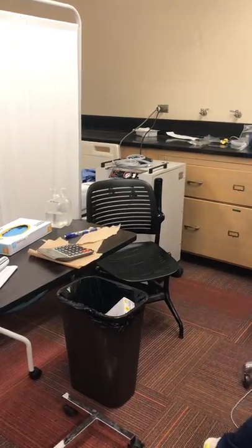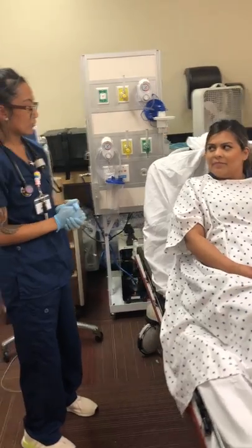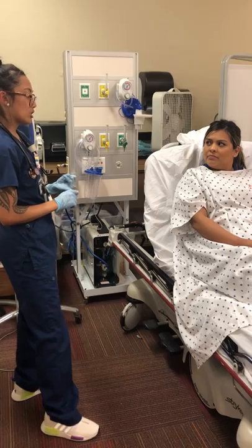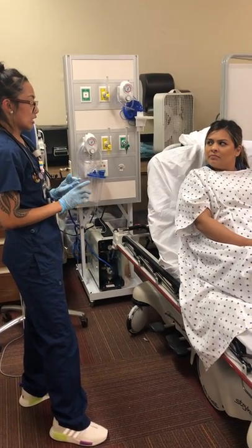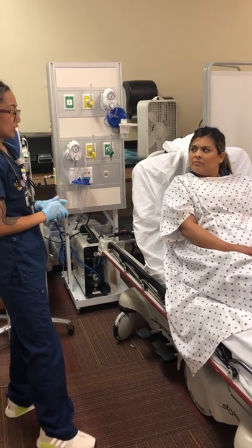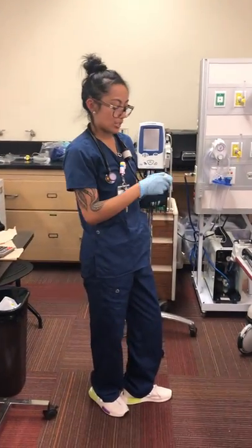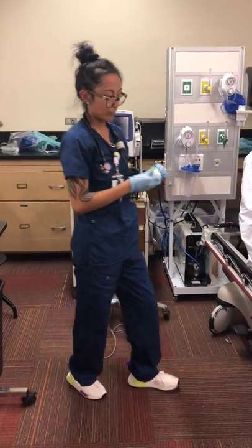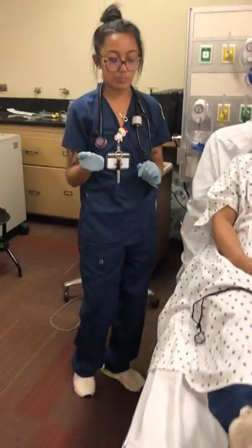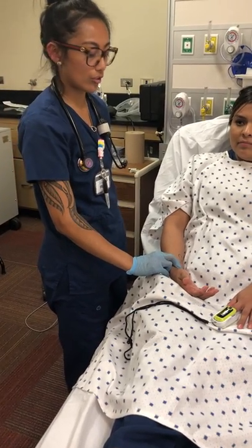Are you able to breathe okay? Do you still feel like you're wheezing a little bit down at the bases? No. From here I'm going to take your vitals again — your respiration, your SpO2, and check your pulse. I'm also going to listen to your lungs again and do your peak flow meter. I'll put the pulse ox back onto my patient's finger and check her pulse for 30 seconds, then do the respirations for 30 seconds.